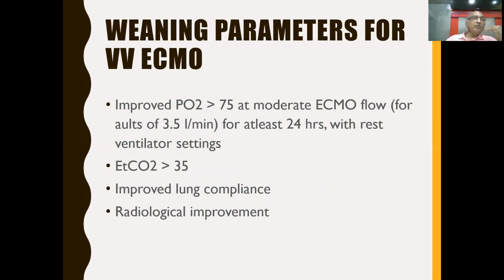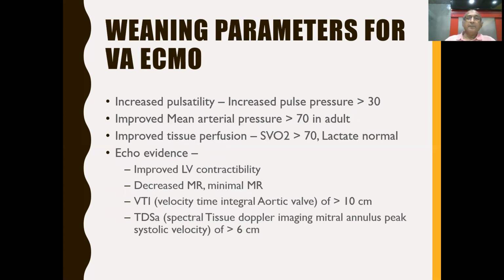When the EtCO2 level goes more than 35, that means the lung is contributing in removing carbon dioxide, that means the lung has improved. Improved lung compliance and radiological improvement, all these things are going to tell you that you can think of weaning the patient from VV ECMO.